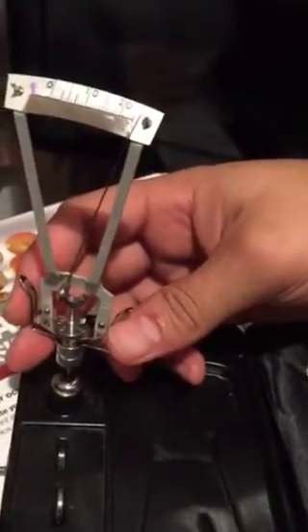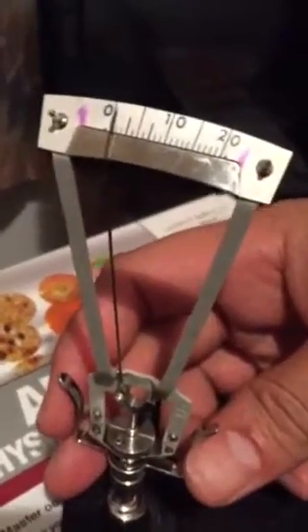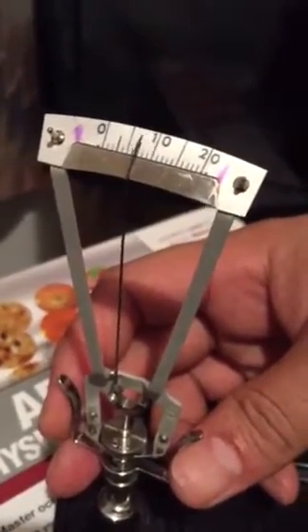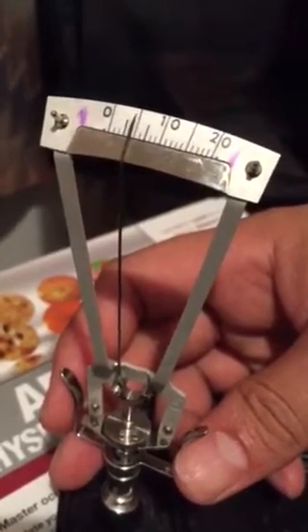Place the device onto the cornea and let it sit freely. So, because this is a piece of metal, we won't get a good reading. But for the sake of practice, we'll say it's a 5.